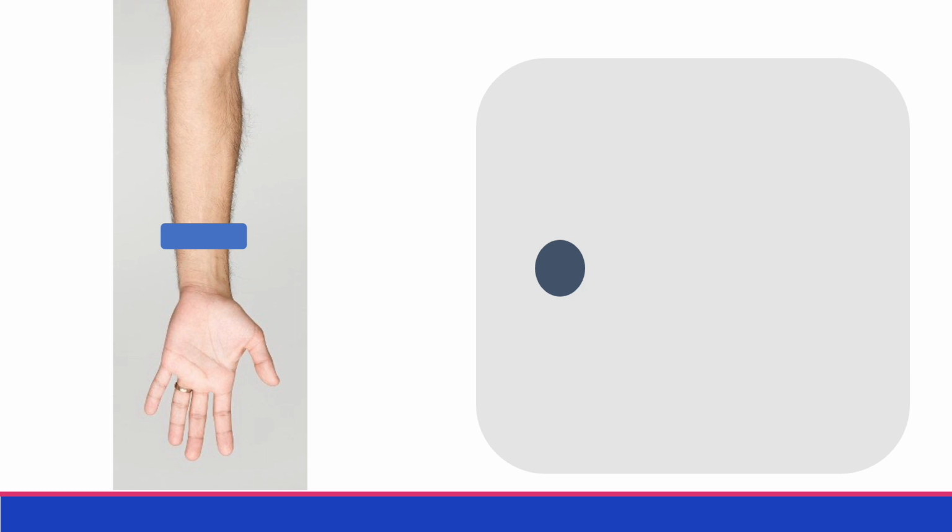So in order to do that, we need to think of our ultrasound as a tool to find the runway. On these next slides, you will see the blue box on the arm move up and down, which is the probe, and on the right you'll see a representation of the ultrasound screen with the black grey circle being the vein. You'll see that the ultrasound probe moves up and down, and that the vein will move on the screen, and I want you to have a think of where you would think that that vein roughly goes in that arm.